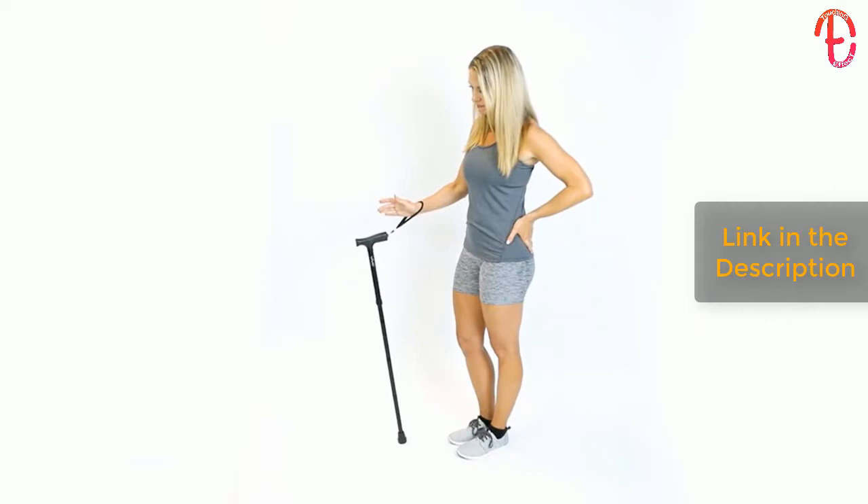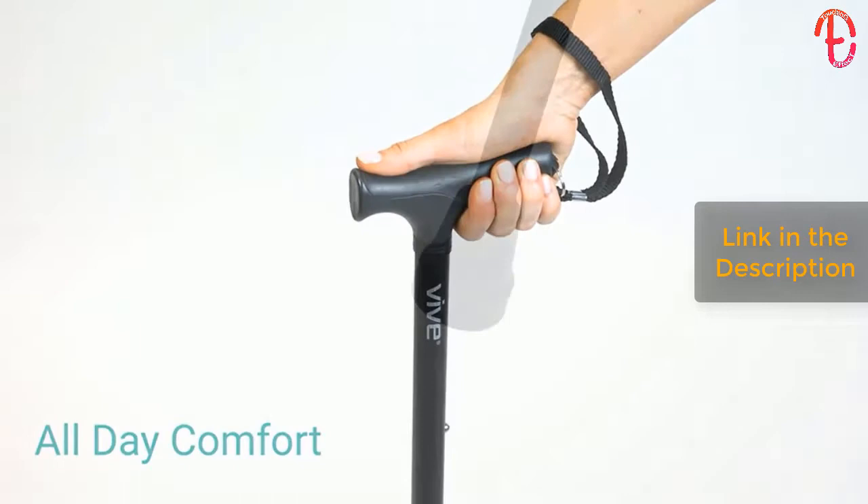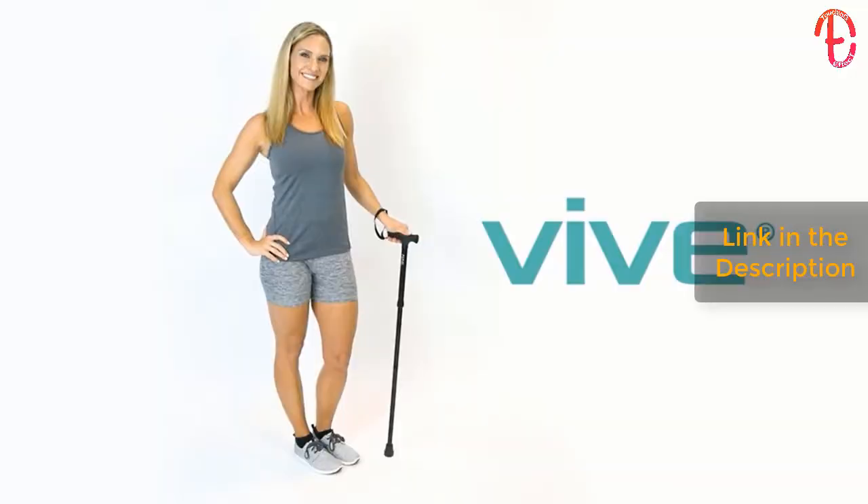An attached wrist strap prevents the cane from falling when released, and the gel handle contours to the shape of your hand for all-day comfort. It's also capped with a slip-resistant rubber tip for additional traction. Let the folding cane by Vive provide you exceptional portable mobility assistance.